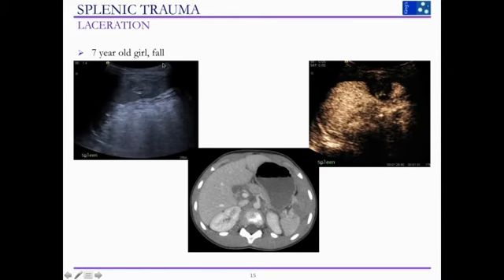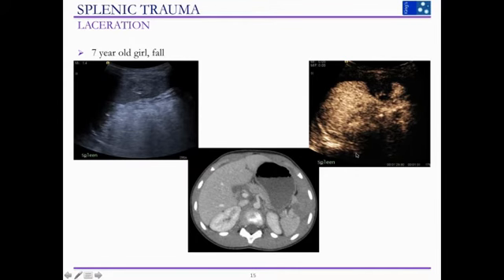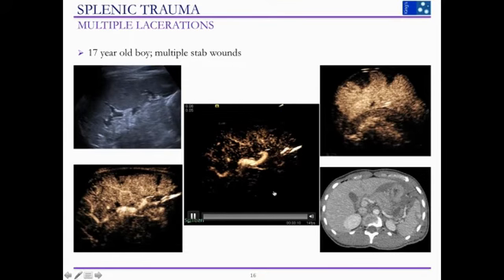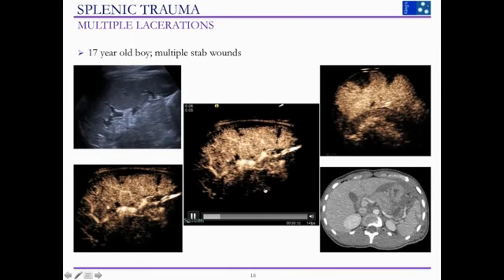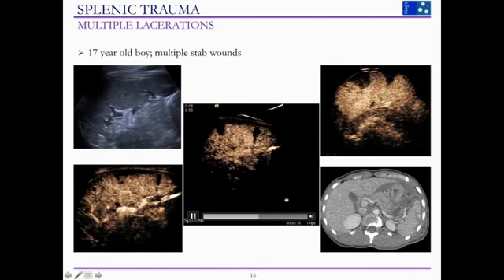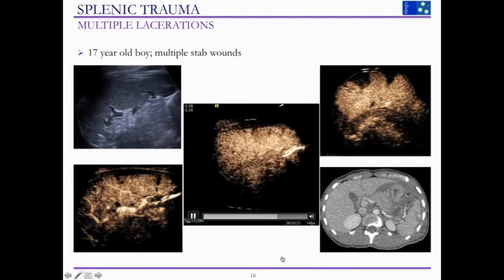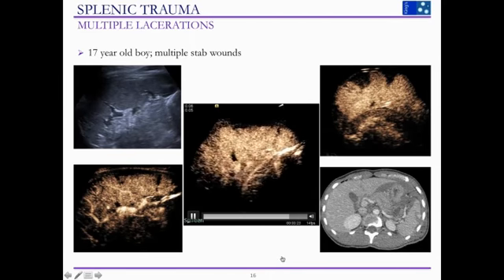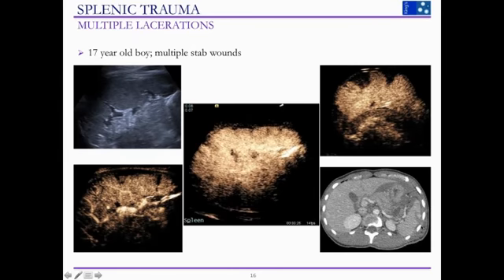Here are a couple of splenic examples. A little girl who had a fall: there is a heterogeneous area in the spleen which after contrast corresponds to the area of laceration, shown as a lack of enhancement — perfectly matching the CT. Another example is a teenager who came in with multiple stab wounds. On initial B-mode ultrasound we couldn't really see the lesions, but after injecting contrast, the lacerations can be seen really easily and clearly — again confirmed on the corresponding CT scan.